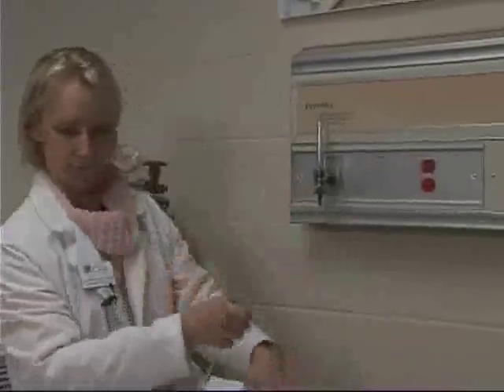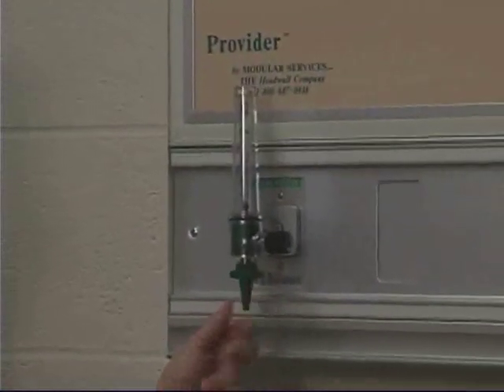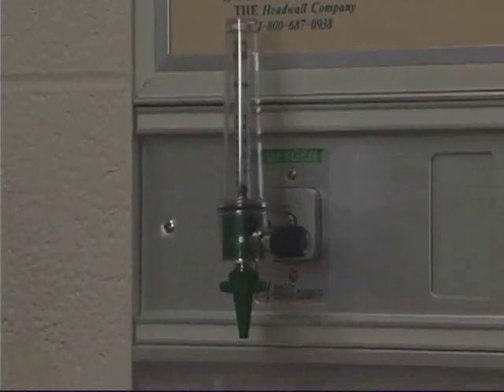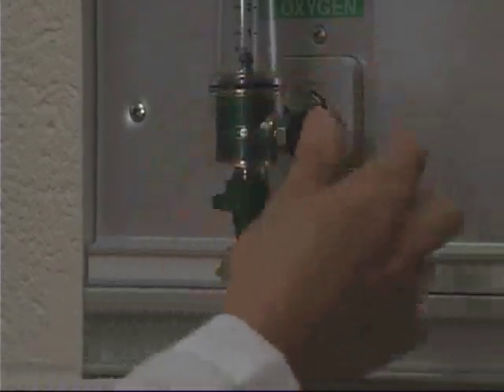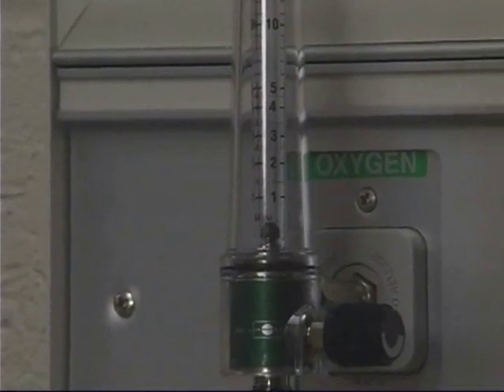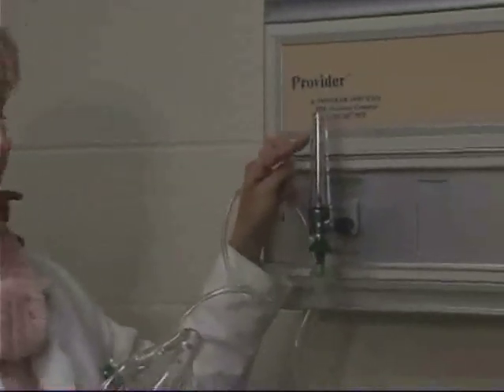Before you put the oxygen on the patient — even for the nasal cannula — you want to make sure that when you turn this flow meter on, oxygen is actually being delivered and that nothing is wrong with it. If there is something wrong with it, respiratory therapy may have to come up and put a new one on. This will get hooked up to your oxygen source the same way on the bottom of this adapter. Make sure it fits securely, and again you'll be turning this black knob to raise the black ball. For the simple face mask, this flow meter is going to be set anywhere between 8 and 12 liters per minute.